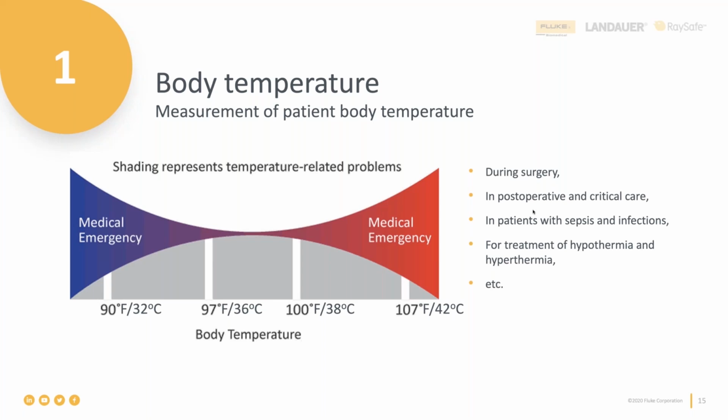The most correct body temperature measurements are derived from measuring core temperature of a human versus shell or skin temperature that we measure these days with COVID with all those infrared and other thermometers. And measuring core temperature is especially critical in the ICU environment. There are actually a few ways to measure and monitor core temperature in the intensive care unit. It can be done using either urinary, nasal, or esophageal temperatures of the body.